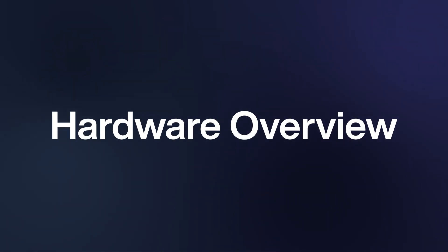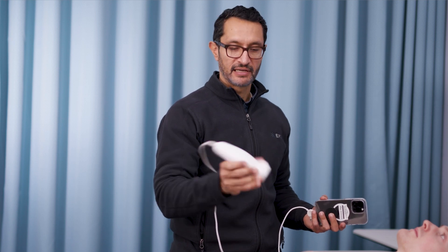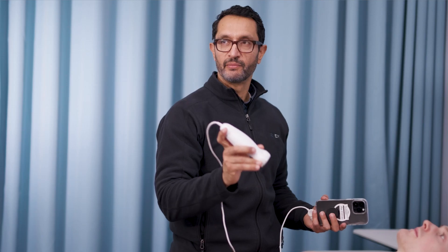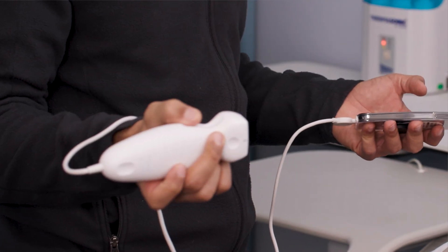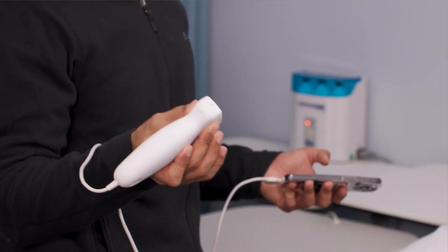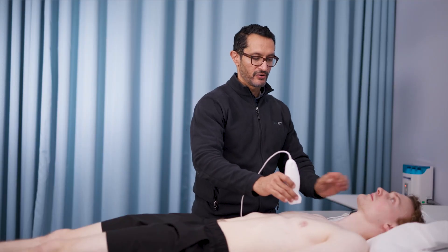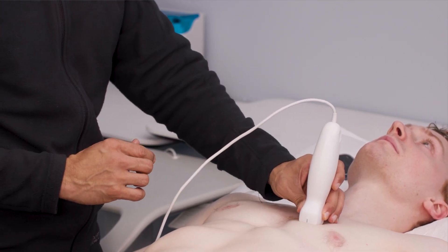Welcome to the Iris. The beauty of this is the probe weight tends to be head heavy, which I like because it allows me to move rather than make it tail heavy. The probe marker is obvious — there's a nice easy bump in the center. Also, when you're doing procedures, you have these two large thumb holders or finger holders right here, which is beautiful because when I'm putting my probe down, I can hold it gently and be very clear that I have complete control.